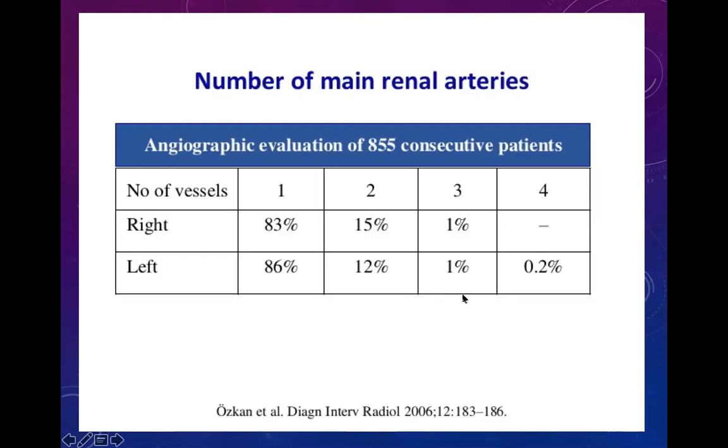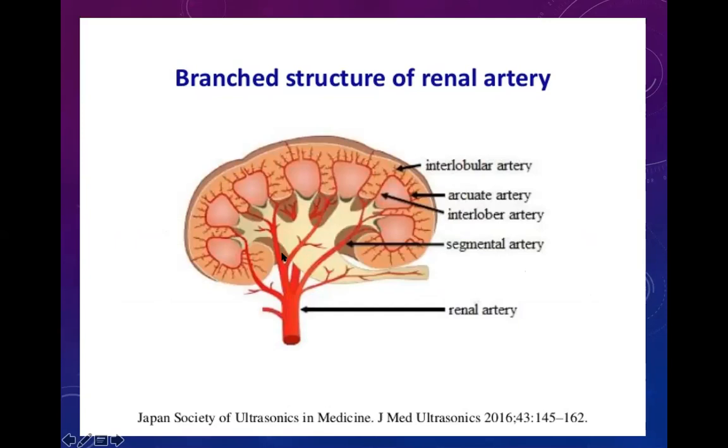So this is at the hilum, before the hilum, where there is a branching of the renal arteries, and then by high power Doppler, you can even see the flows in the segmental arteries, the interlobar arteries, and arcuate arteries. Interlobular arteries are difficult to insonate, but you can see the flows happening because it's a very, very high flow. So of interest to us is still the hilum and the segmental arteries, which will give us the clue about the velocities.